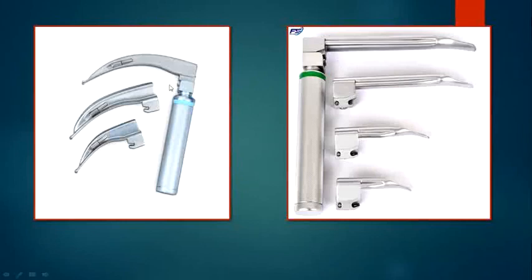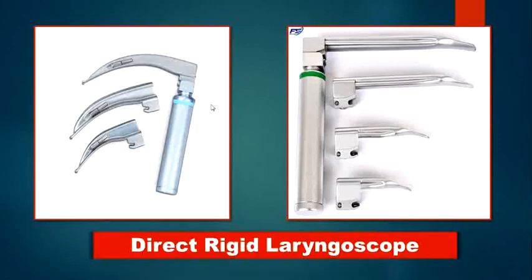Of course, the parts of the laryngoscope: this is called the blade, this is the light source, and this is the handle containing the battery, used in fixation or introducing the laryngoscope. The full term is a direct rigid laryngoscope.